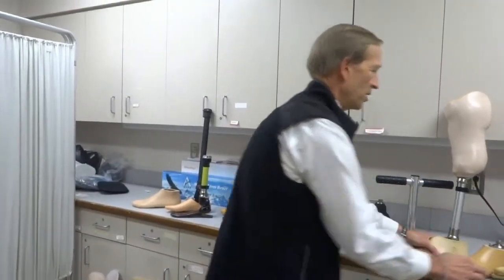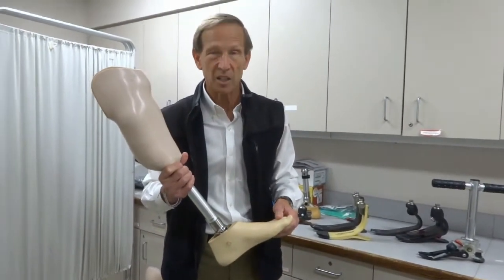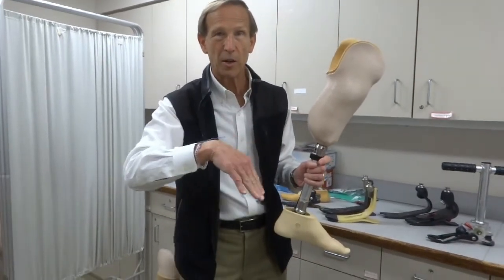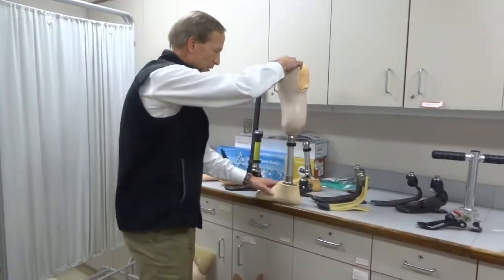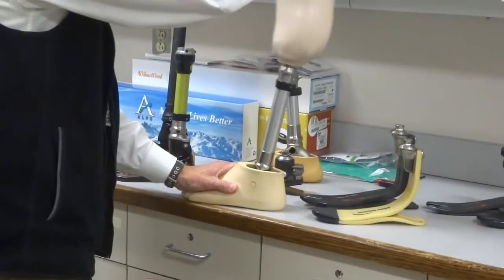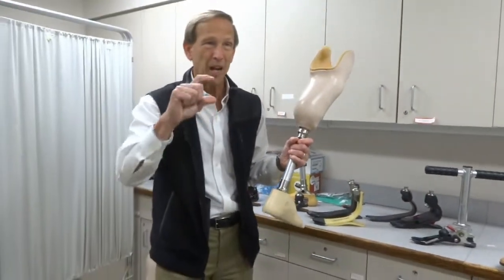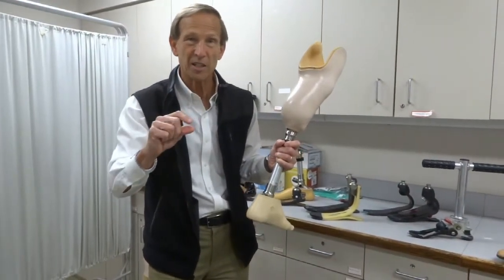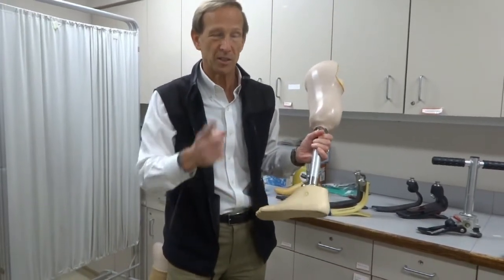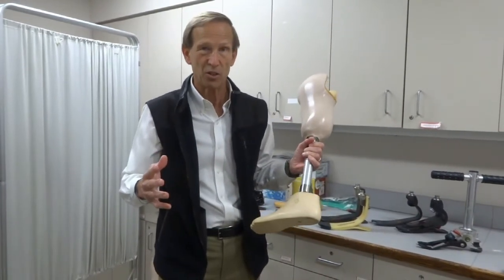For patients walking indoors, you're also allowed to use what's called a single axis foot — a foot that pivots up and down in one direction. You can see how it tilts up and down. There are rubber bumpers in there that determine how much it bends or how soft it is, but it's still very lightweight and very simple, and qualifies for a level one patient walking indoors on a relatively flat surface.